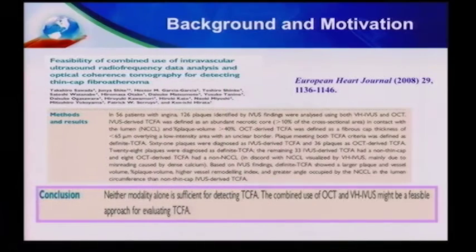About 6 years ago, there was a study which motivated us to look for a way to solve that problem. In that study, people used OCT and IVUS to look at patients with the two imaging technologies separately, and then combined the histology analysis with the two imaging modalities.